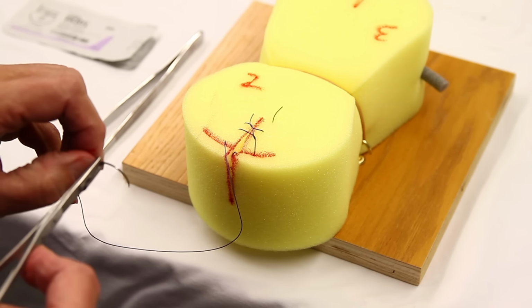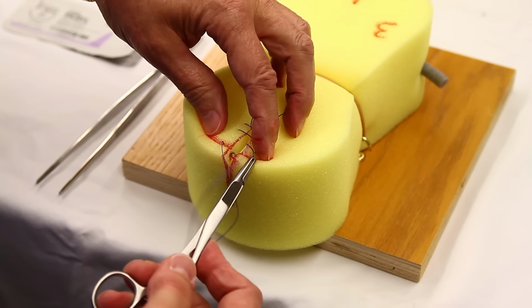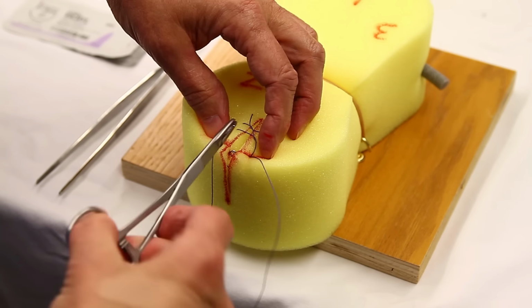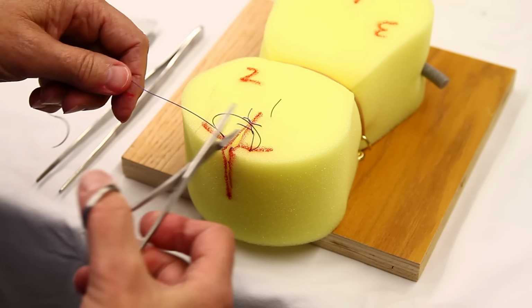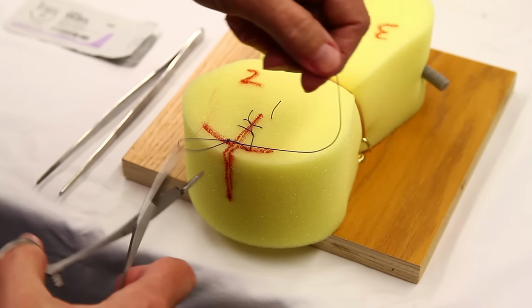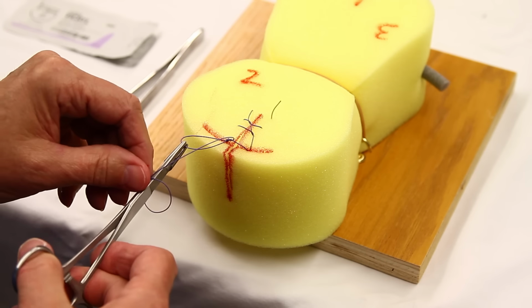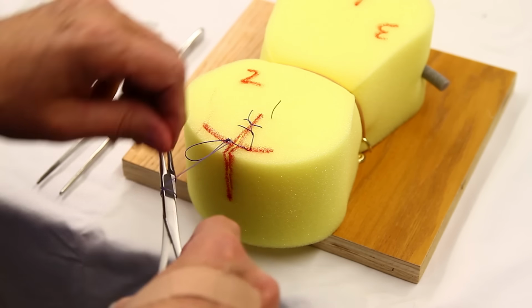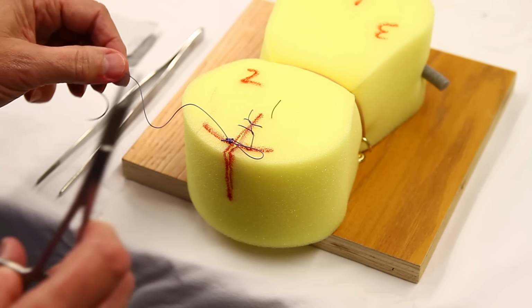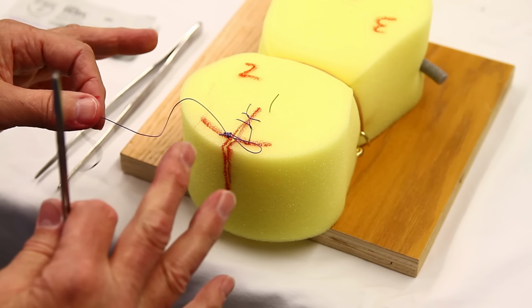Now a final stitch for knot tying. Go directly across, right on the hymeneal ring, and bring the stitch all the way through. And now we have a loop for tying. It's just a simple tie with 4 knots. This is Vicryl, so one of the knots should be a double knot, double loop. Vicryl tends to untie itself. I won't tie it tight because I'd like to recover this suture for the next student, but that's exactly how we do it.